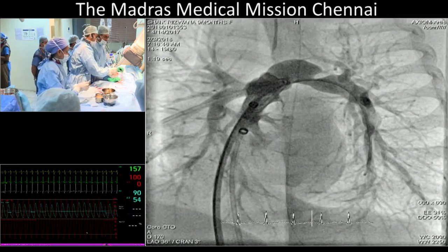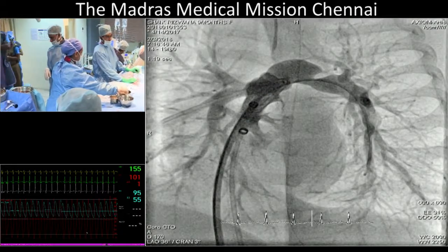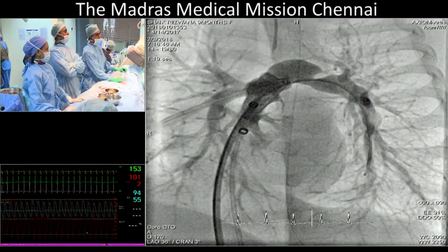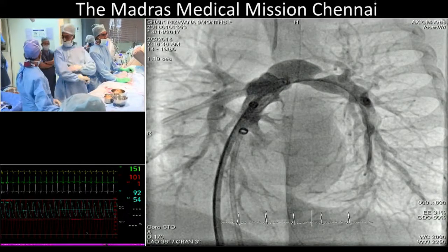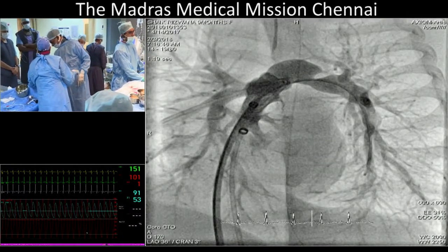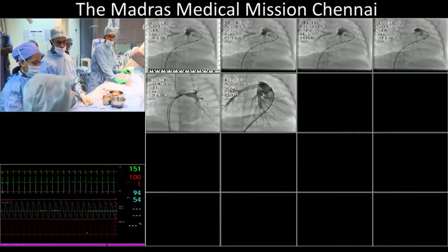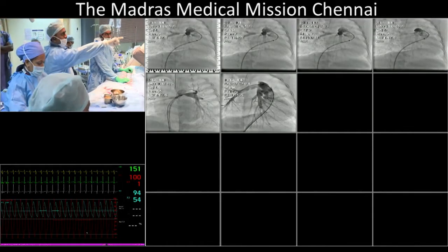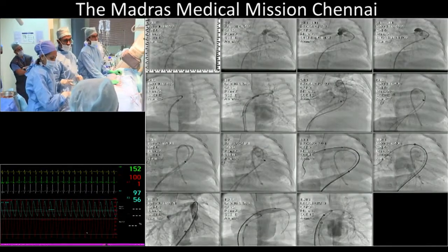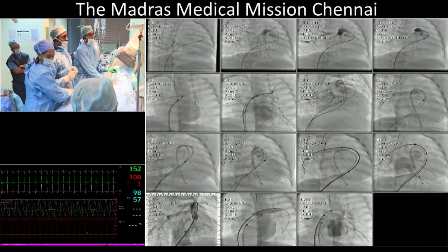It's not a membrane. You said it was a 9 millimeter branch pulmonary artery, so why not go with a bigger balloon? I don't quite understand why the right ventricular pressure rose to suprasystemic level. Is there any dynamic reason for that? Show the last LPA again. Is it anatomical? Because the flap in the left pulmonary artery shouldn't be that obstructive to increase the right ventricular pressure that much.